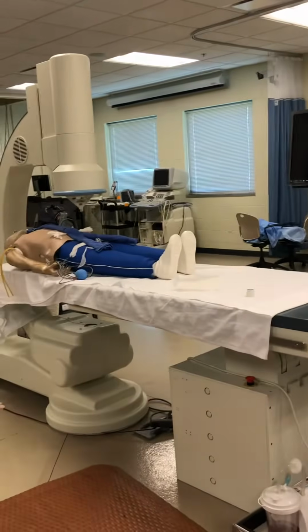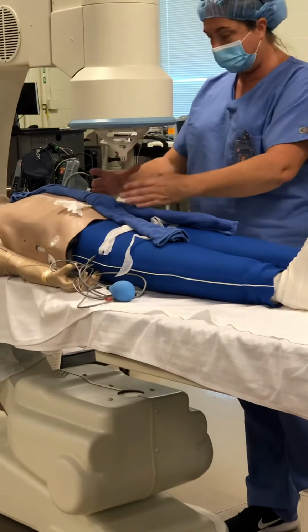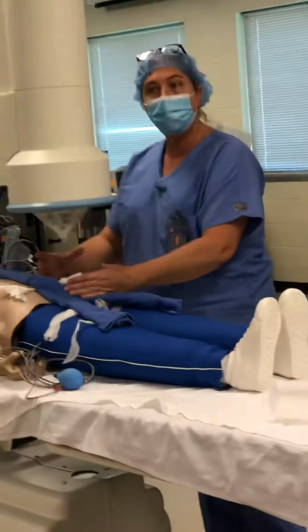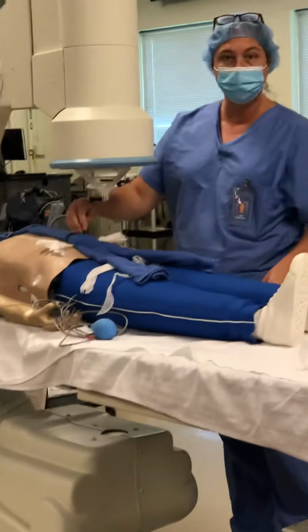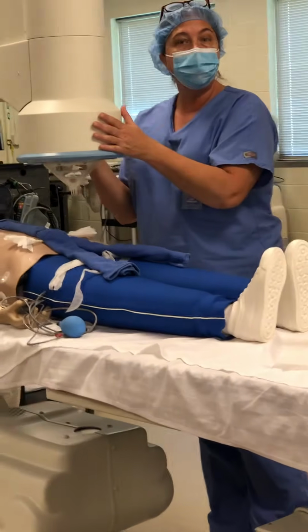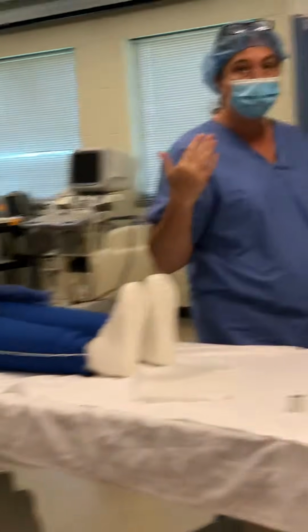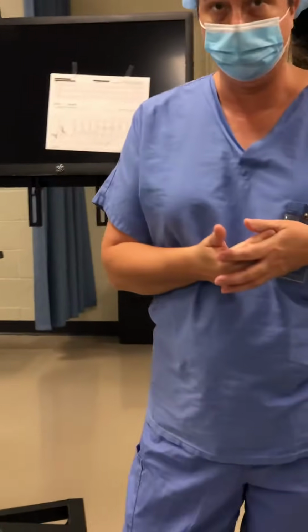Because remember, we want to be able to see this kidney completely in our image. So we want that centered up. So we wouldn't be in the center of the aorta anymore. The image or the projection is a straight AP. Pretty simple. That's for your left renal.